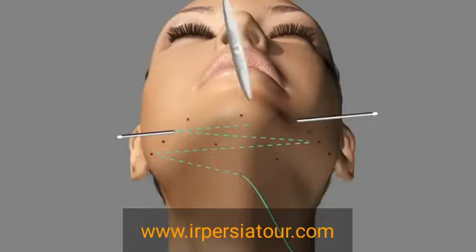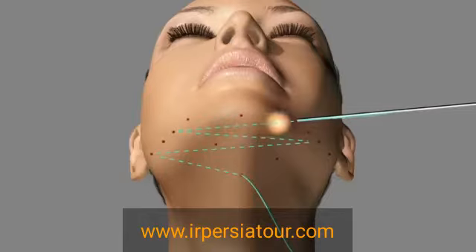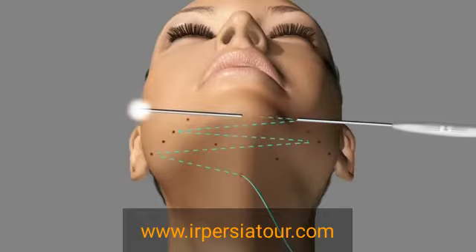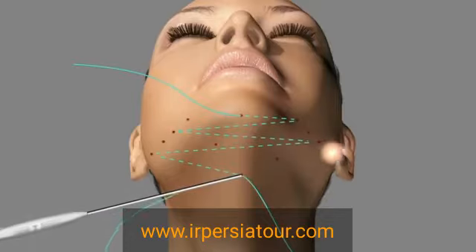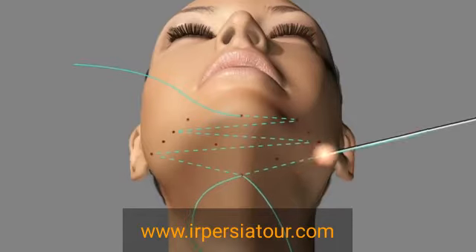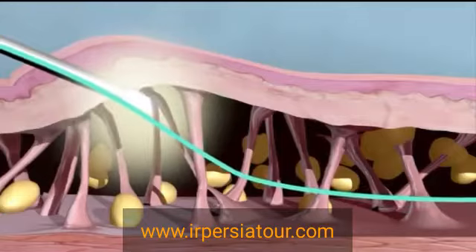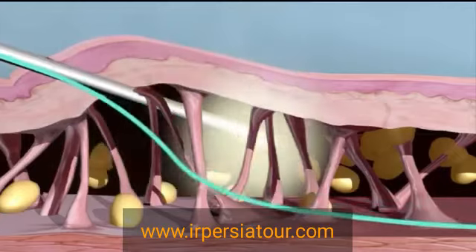It's important to note that with each passage of the rod underneath the jawline, if there's any difficulty, it is okay to puncture and make a new pivot point underneath the jawline. The rod was designed to be straight and should not be bent during this procedure. Therefore, if multiple pivot points are needed to travel around the curved surface of the jawline, they are necessary and will allow the easy placement of the suture matrix. Once again, illustrating the rod as it is rotated, encircles the ligaments, and then engages and is advanced downward underneath the jawline.